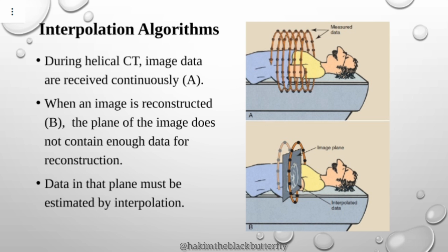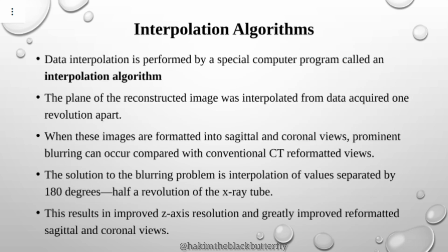When we have some missing information, for example, in the previous thing that I've drawn for you, interpolation can be done such that these slices can have enough information to display. Data interpolation is performed by a special computer program called interpolation algorithms.